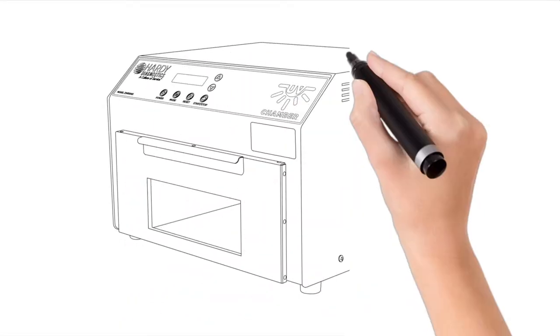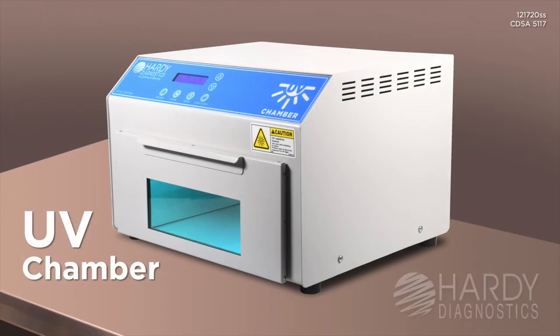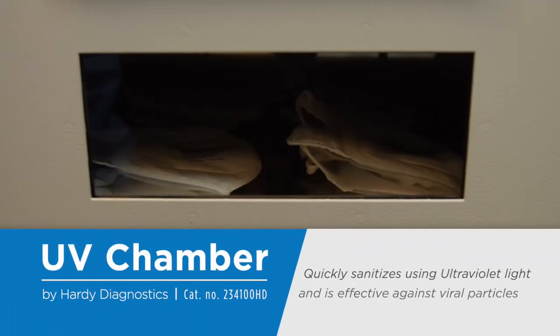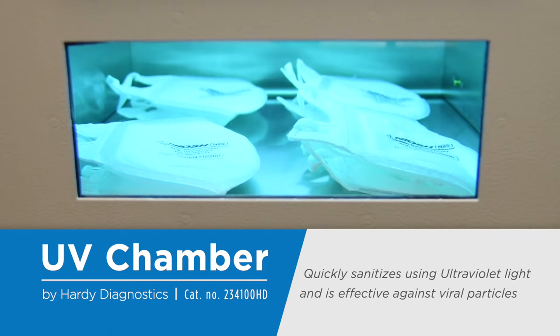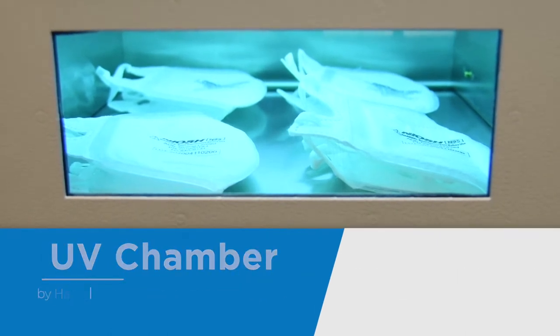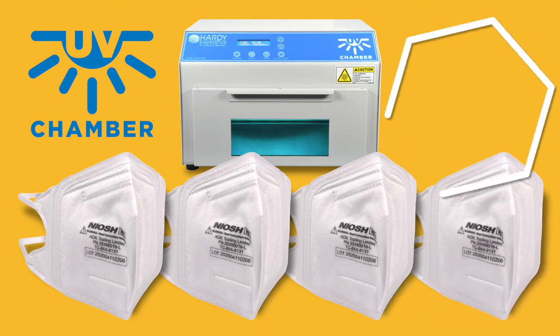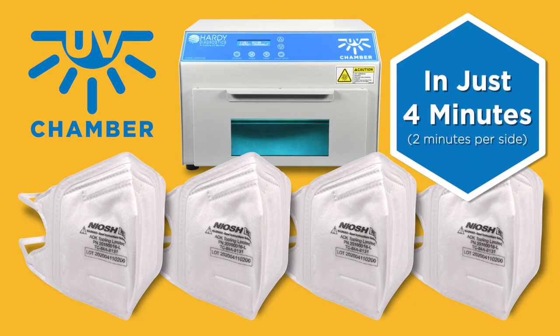Never run out of N95 masks again with the UV Chamber from Hardy Diagnostics. The UV Chamber quickly sanitizes using ultraviolet light and is effective against viral particles. The UV Chamber can sanitize up to 4 N95 masks at once in just 4 minutes.